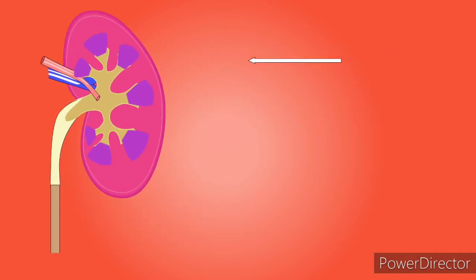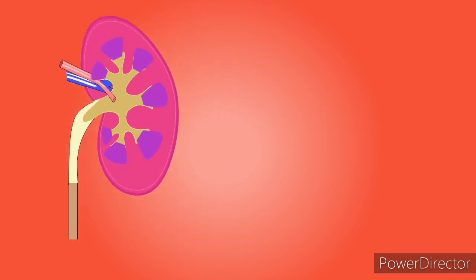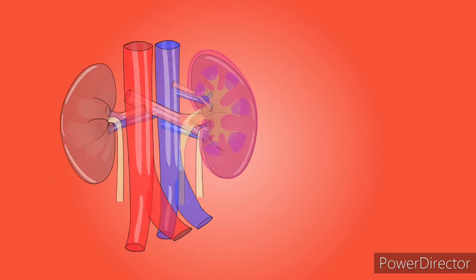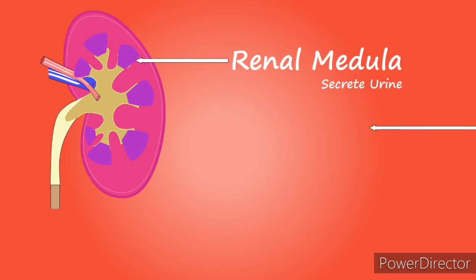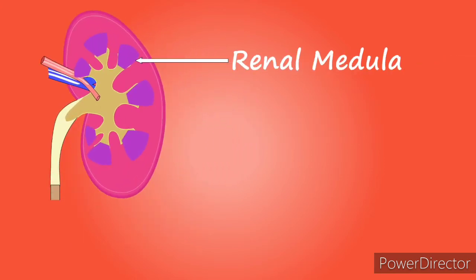So the next thing is which urine sample is ideal. What is the ideal urine sample for urine analysis? The ideal urine sample is the first freshly voided early morning urine. That is the most reliable specimen for examination of mucus, pus, and other cellular elements. It is also of value when it comes to pregnancy test.